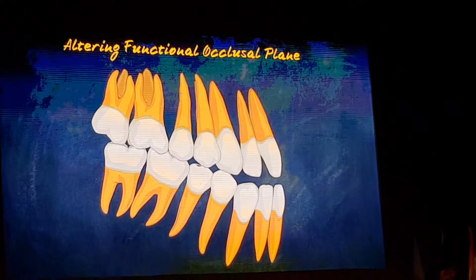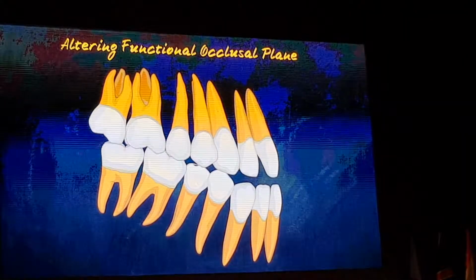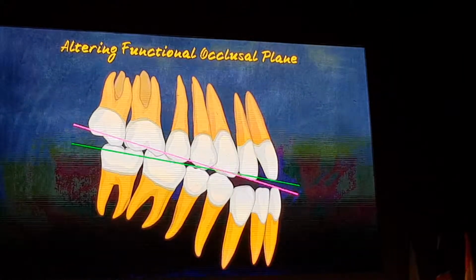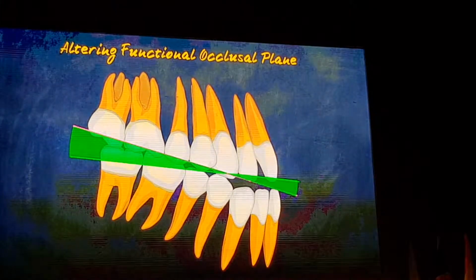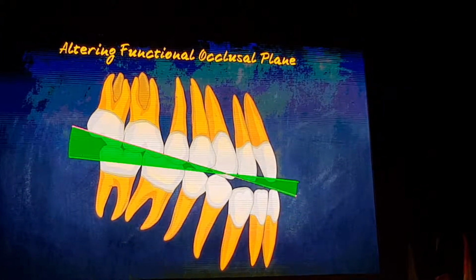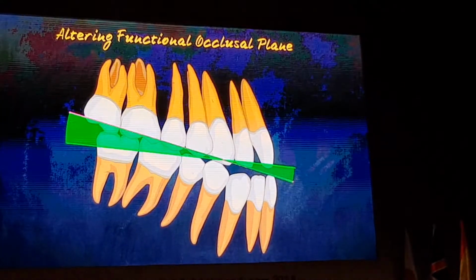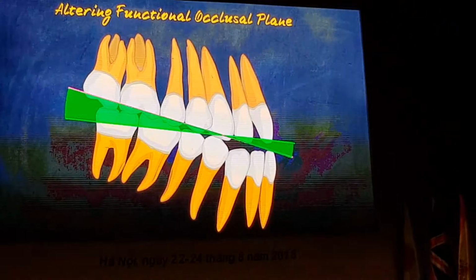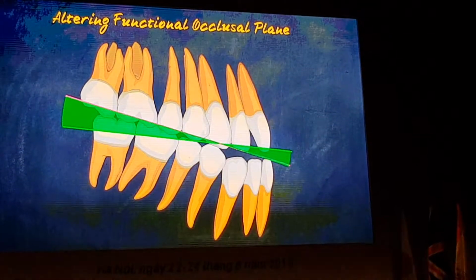So here is the idea to alter the functional occlusal plane for this patient. This is what I want to do, to tip back and intrude lower molars, and extrude lower incisor a little bit, and extrude upper incisors.